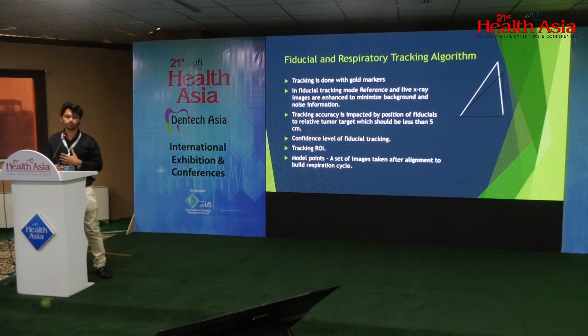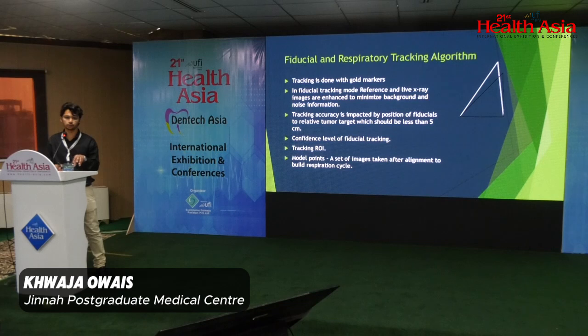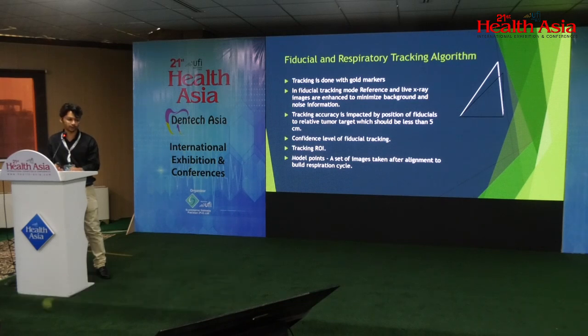At first, the technologist verifies that it is tracking the patient, and when we're about to start the treatment, the robot itself gives us how much confidence it has that the tracking is being done. And then of course, there's a specific region of interest specified that the robot has to search for these gold markers or the tumor within the specified range.